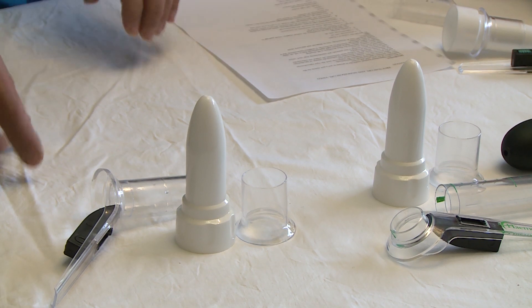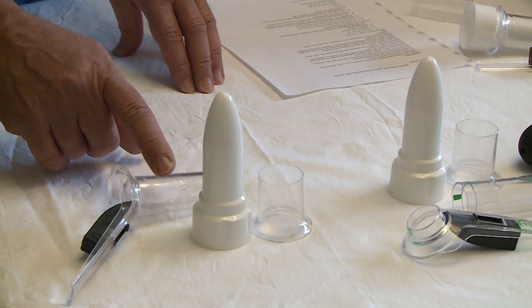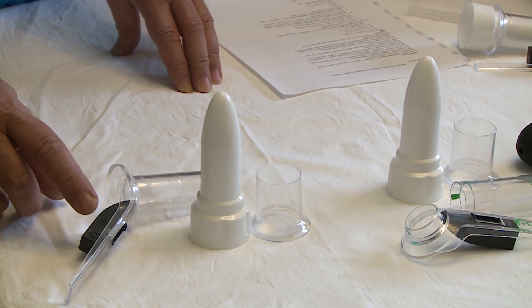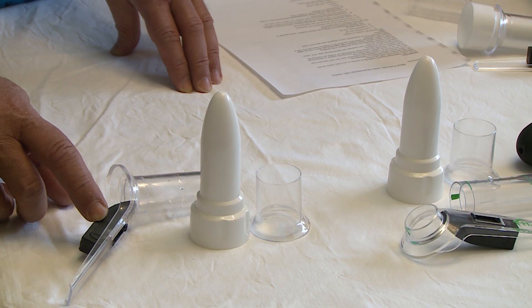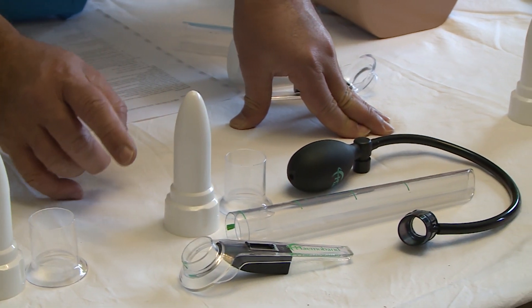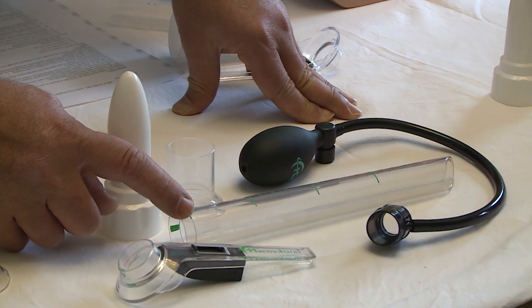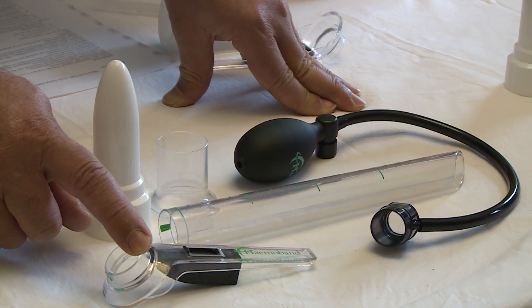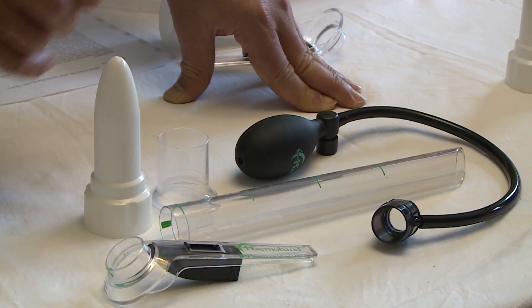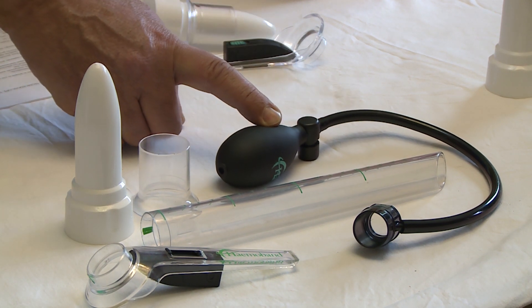The proctoscope set contains the trocar, the sleeve, and the main body of the proctoscope, with the detachable handle and light module attached. The sigmoidoscope set contains the same sleeve and trocar, the main body of the sigmoidoscope, the same handle with light module, and the lens and air pump module.